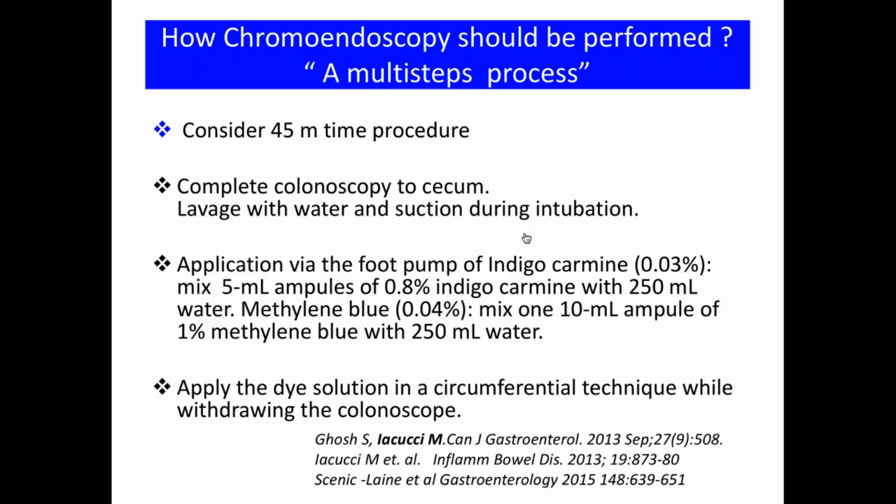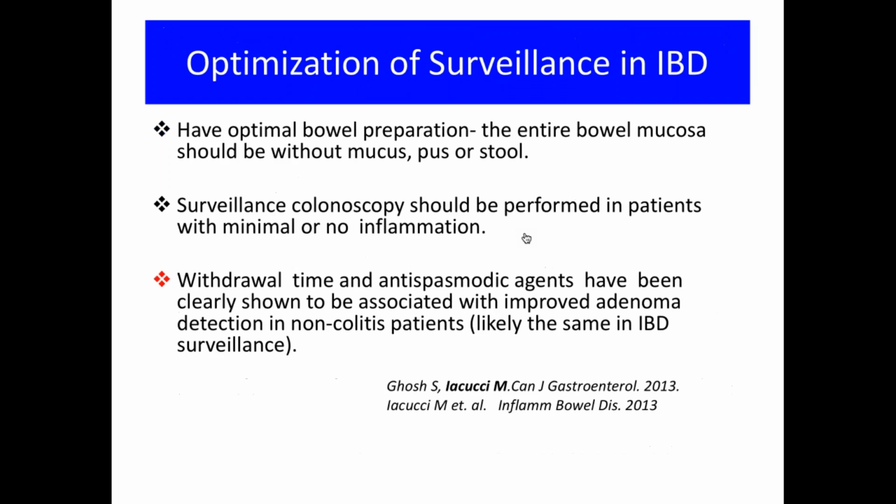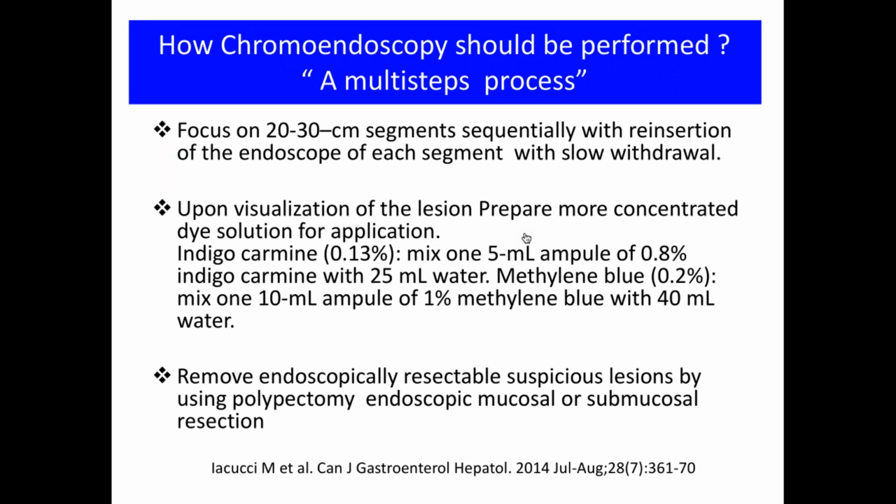I consider 45 minutes for my procedure, and I complete my colonoscopy to the cecum, and I try to clean as much as I can and suction all the extra debris and liquid during my insertion. And then in the withdrawal time, I start with my foot pump jet, and I just paint with the indigo carmine. And circumferentially, I analyze and I inspect every 20-30 centimeters of my colonic mucosa.